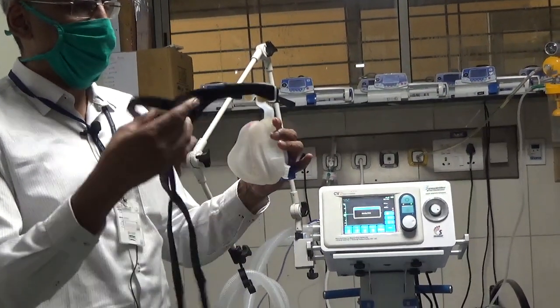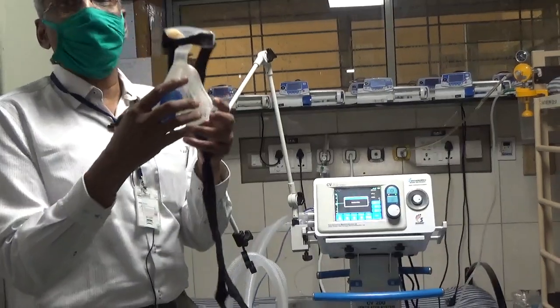Now, when we fit the mask, it is important, you know, the mask is claustrophobic.